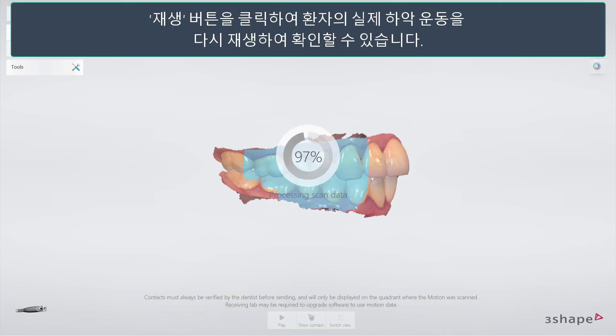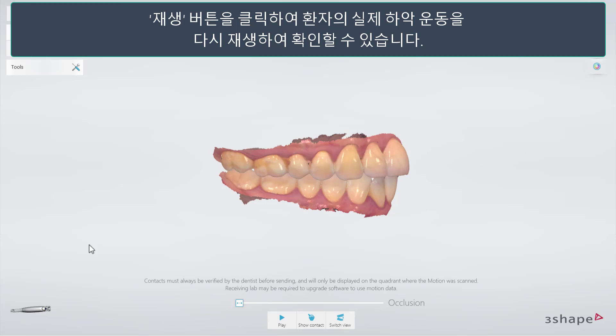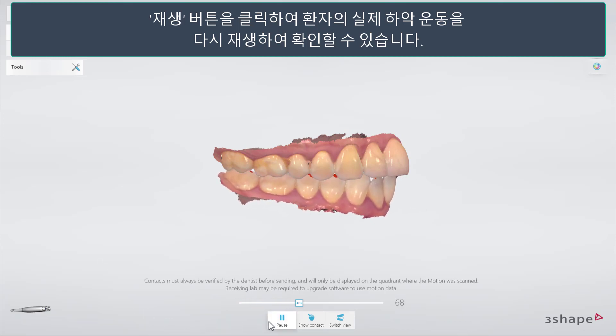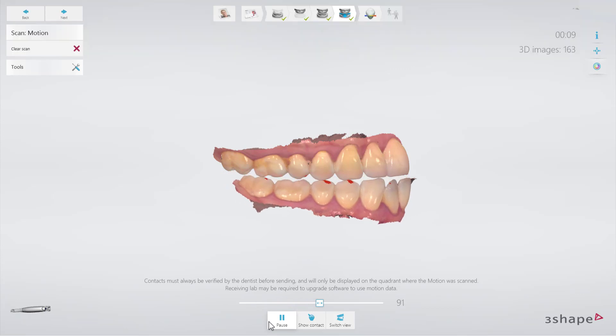It is now possible to replay the movement of the patient by clicking the Play button. This will replay the actual movement of the patient.